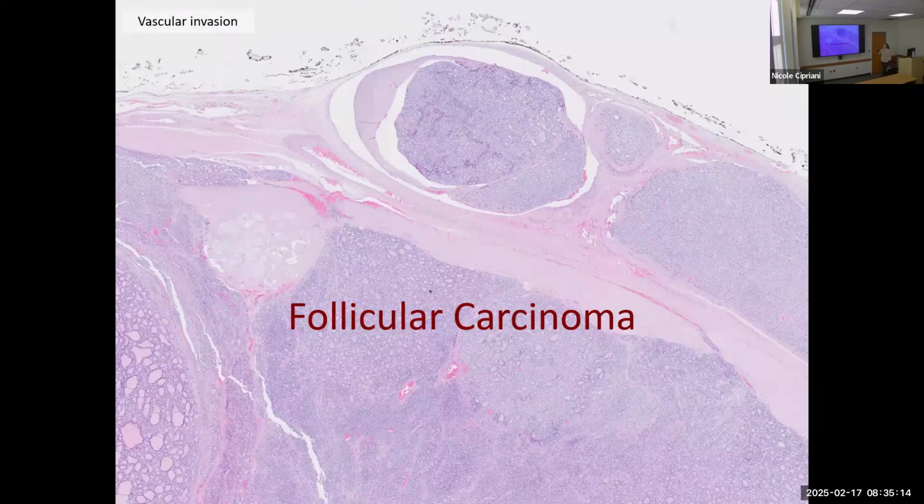Certainly, angioinvasion or vascular invasion, 100% is cancer. And when you guys are looking for angioinvasion, you're not looking for one cell or two cells or like a cluster. You're looking for a big muscular vessel, which is generally a vein, in which there's a tumor plug that is completely surrounded by endothelium, often with some sort of fibrous adherence to the wall or fibrin thrombi that tell me that there's been breach into the vessel with endothelial injury and activation of the clotting system.